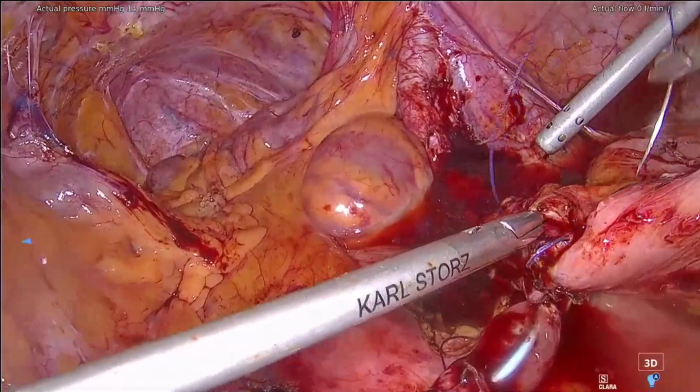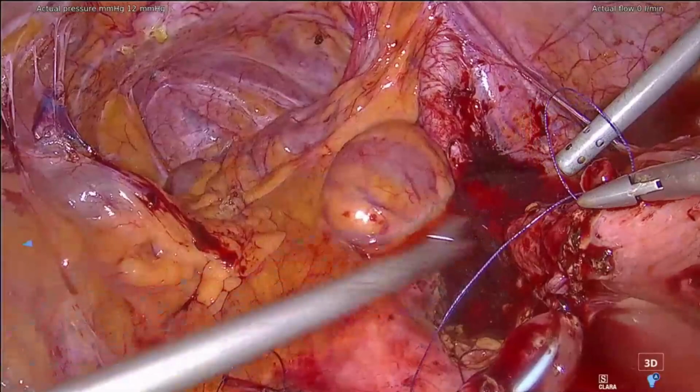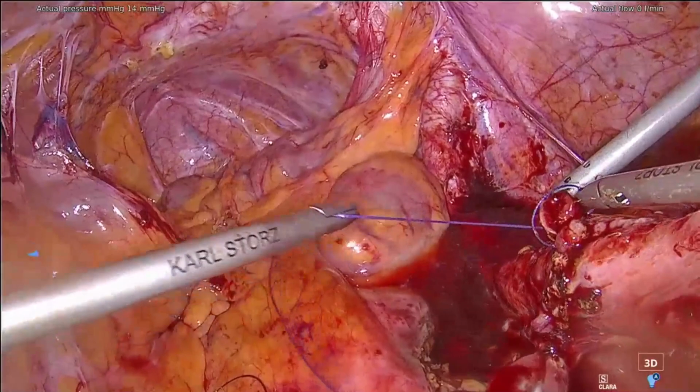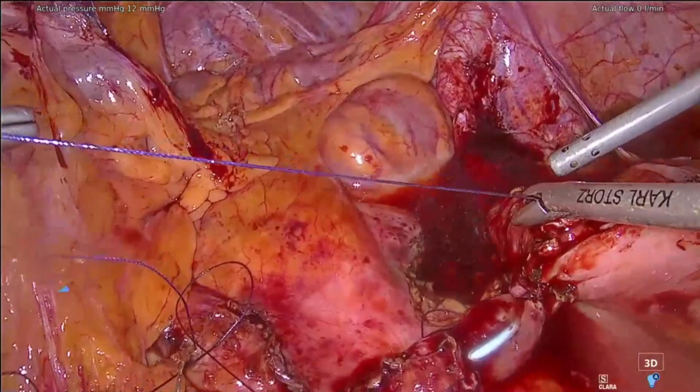I have to be careful because I remark that the patient has a dilated loop. Then it means that maybe the stoma is a little bit small in the passage of the wall, and then it's a good candidate to have a urinary leak. Then if you have a leak, we have to put a bladder catheter inside the loop just to be sure that it's drained well.